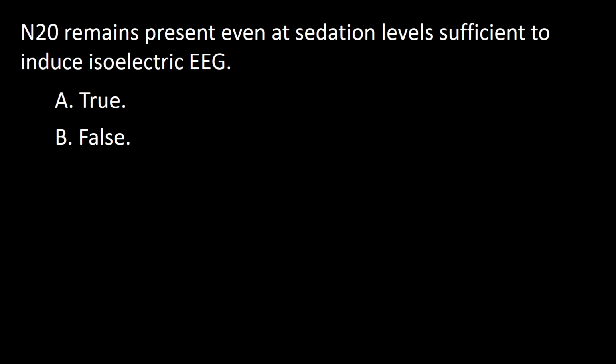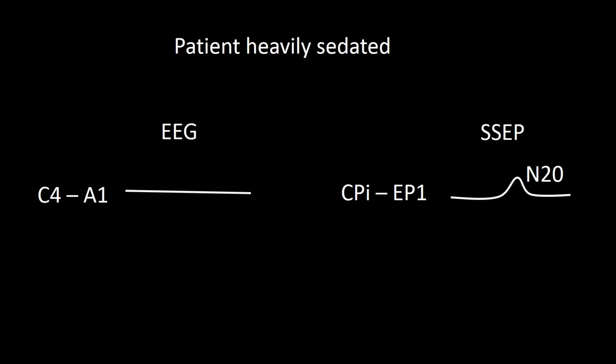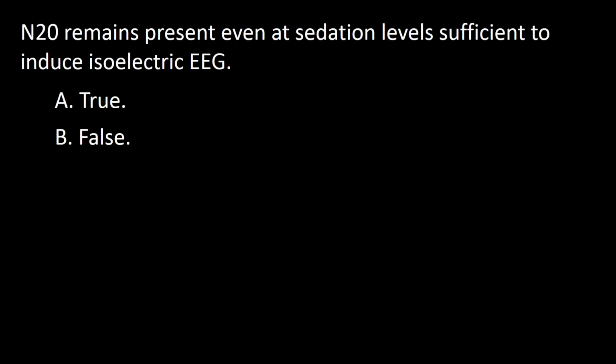Next question. N20 remains present even at sedation levels sufficient to induce isoelectric EEG. A. True, B. False. Heavily sedated patients with flat EEG tend to have preserved N20. So the answer to this question is A.